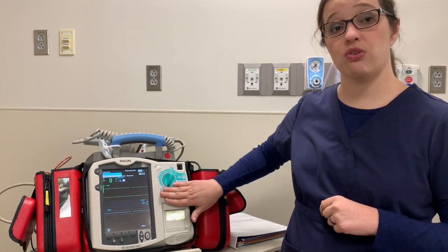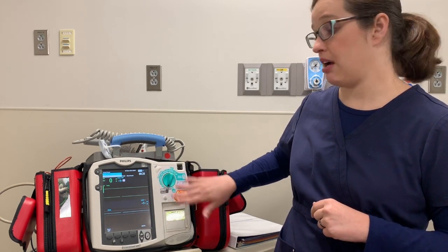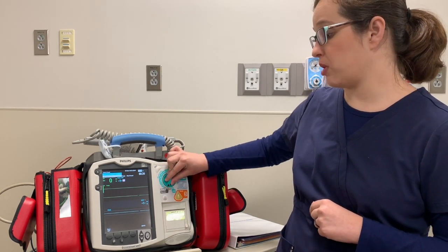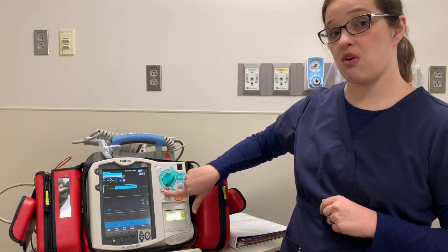We do not ever use the monitor setting during a code situation — it should always be on something else. That is only for if you're transporting a stable patient. You do have a pacer setting that we're going to go over in a little bit.